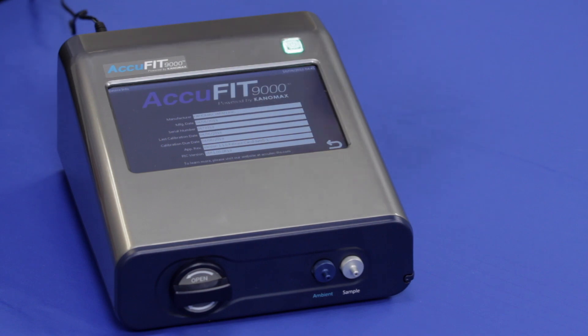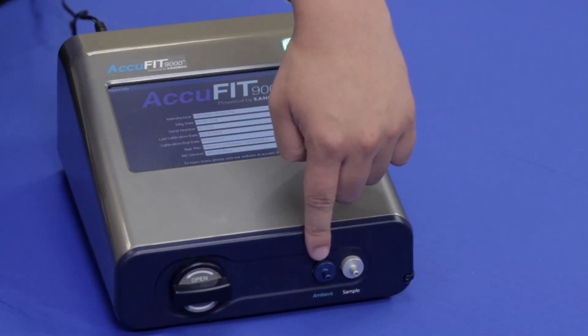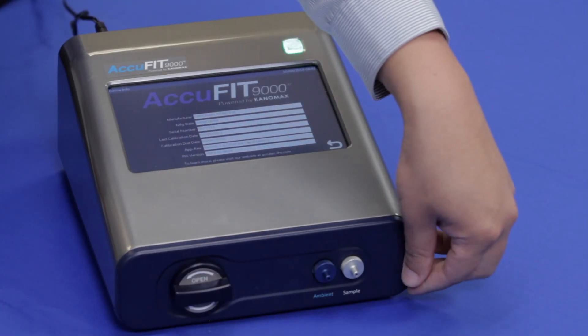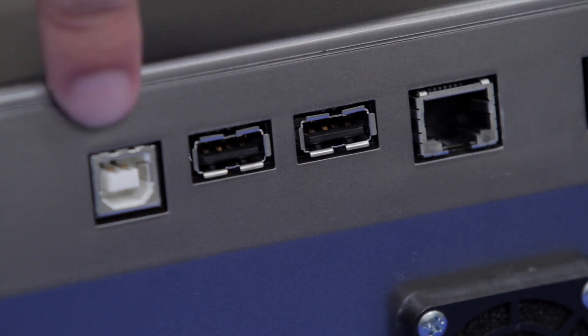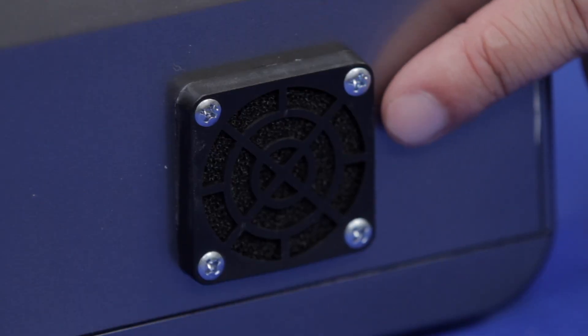The main unit includes the power button to turn the instrument on and off, a touch screen to operate the system, inlet nozzles for both ambient and respirator sampling, alcohol cartridge, stylus pen, USB and LAN ports to connect a PC, USB flash drive, keyboards or printers, and a cooling fan.